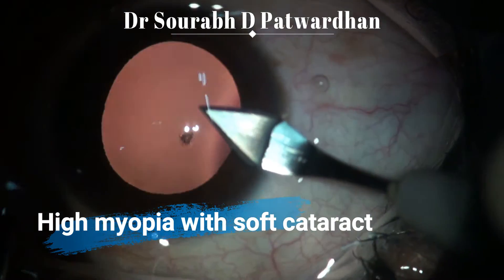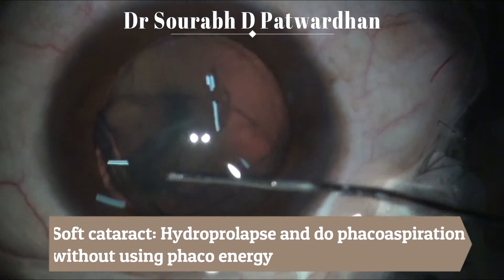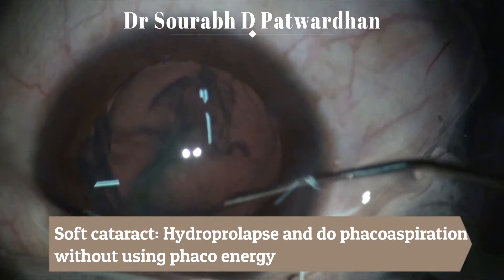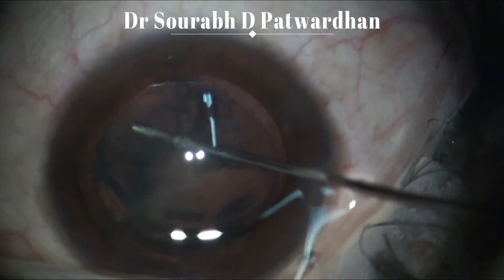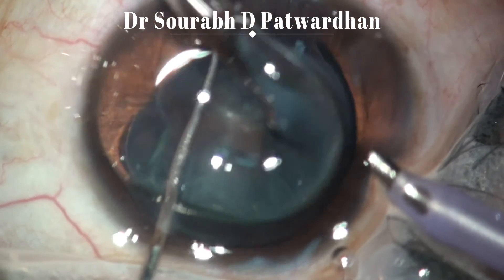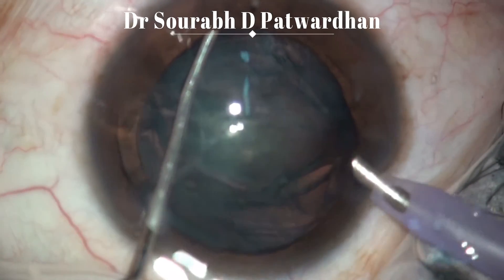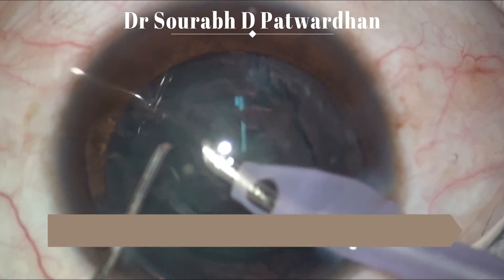In cases of cataract surgery with high myopia where the cataract is very soft, I generally use the technique of prolapsing the nucleus out of the bag after doing a good-size CCC, and then phacoaspiration of this prolapsed nucleus without using much phaco energy. Because we are not using much phaco energy, the endothelium will not be damaged, and doing all the maneuvers quite anteriorly avoids any posterior capsular problems.